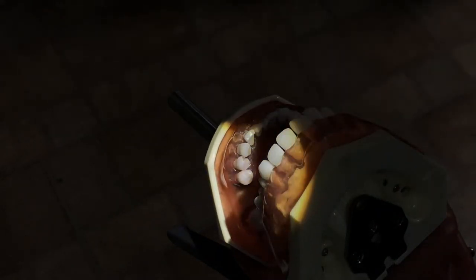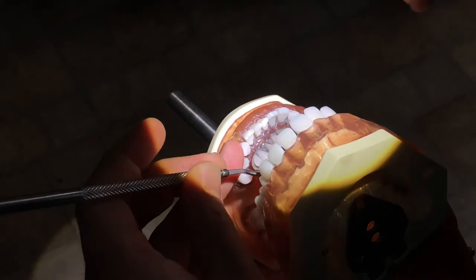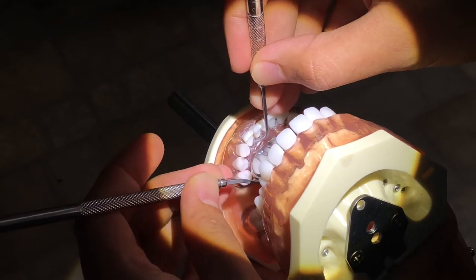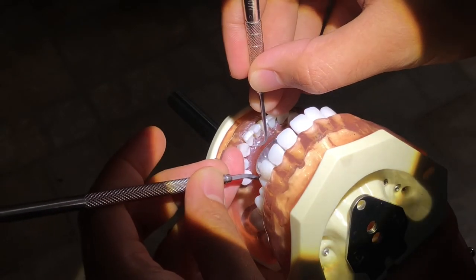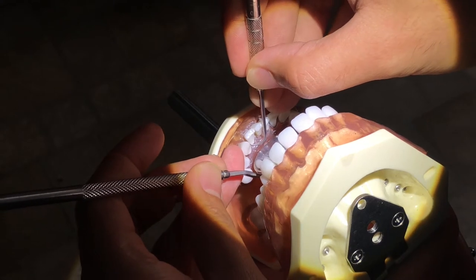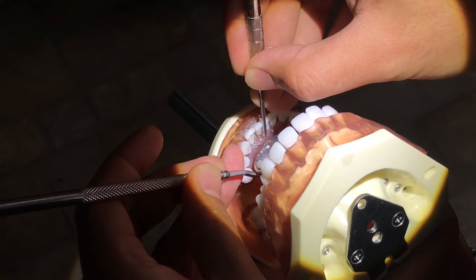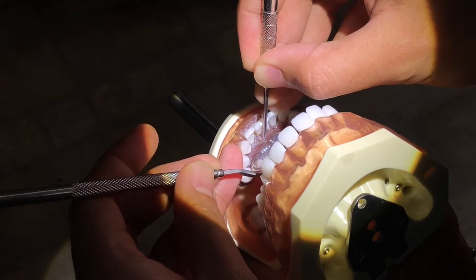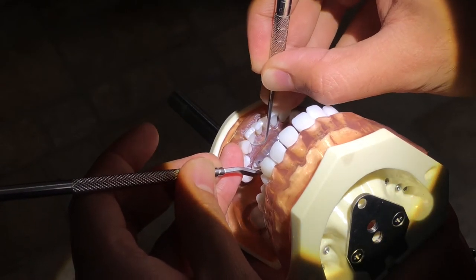Using a scaler, I'll be instrumenting tooth number 23, the distal lingual aspect of it. I'll put my mirror here and go to the ready position. Tooth number 23 is this one. Ready position and then activate and adapt.